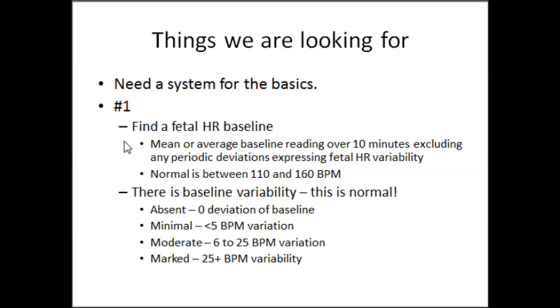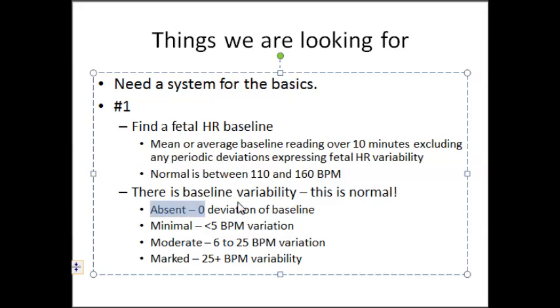However, I just like to think over the long run, you will get baseline variability, meaning the baseline shouldn't always be 140, for example. Maybe it'll bump up to 145, maybe it'll go down to 130, but really you'll see kind of a change over time. Now, if there's no variability, so if it stays at 140 for a period of 3 hours, you may be a little worried because you'll see absent baseline variability.